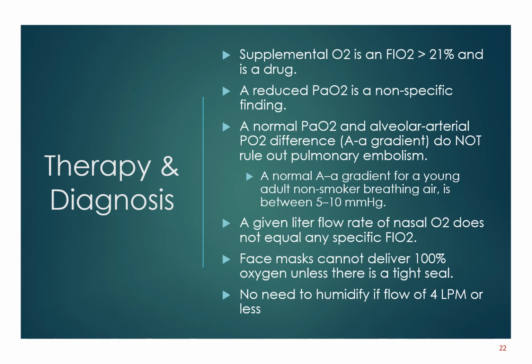So let me cover some tidbits of oxygen therapy. Number one, supplemental oxygen is a drug. So anytime you give oxygen therapy to a patient, you need an order. It is considered a drug. And anything above 21%, 24%, 30%, 40%, whatever you have, that needs an order from a physician. So think about this. Oxygen is a drug when you administer it to a patient.